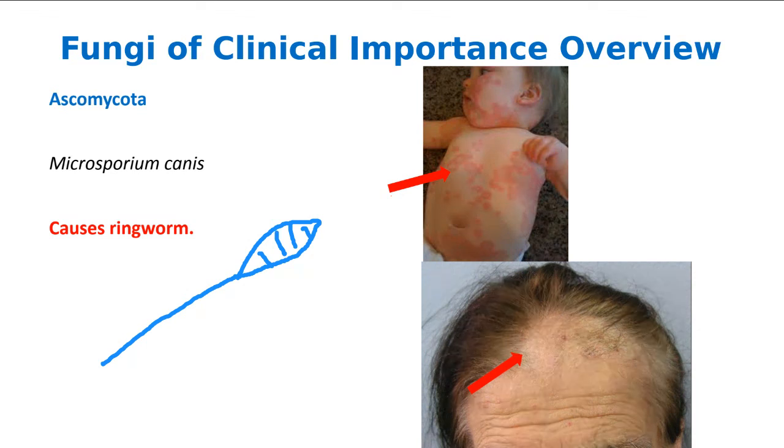So like the ringworm in the baby, oh, ringworm is not a yeast; it's a mold. Oh, yeah, that one is transmittable. So babies can spread it to each other, and kids can spread it to each other. You know, Amy, if you had to have an infection, ringworm is the one to get because it's easily treated. It just looks bad. And you can get it from your dog too.